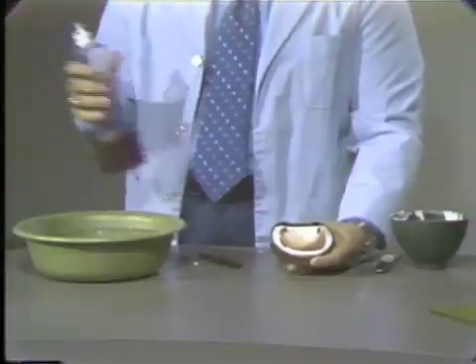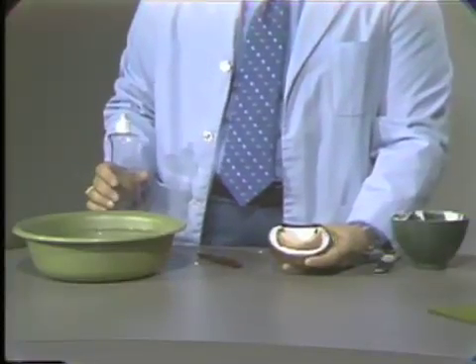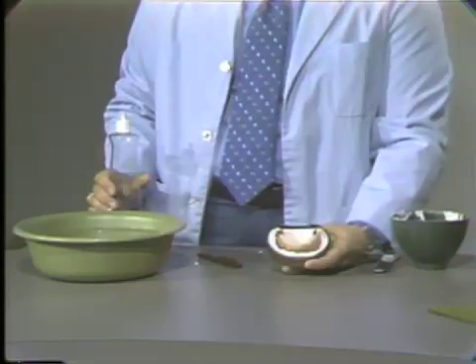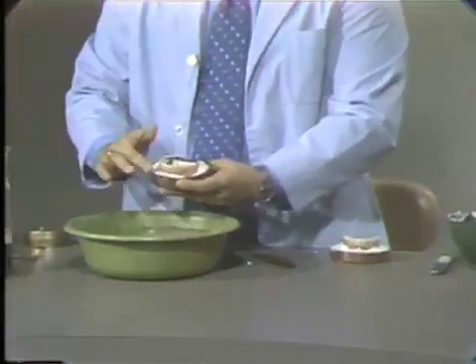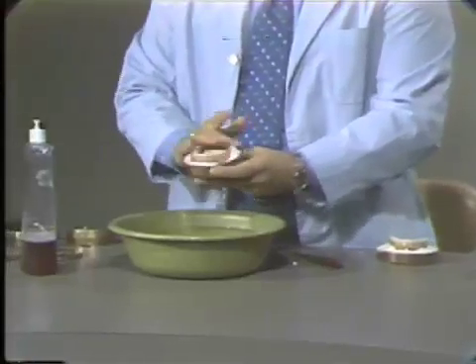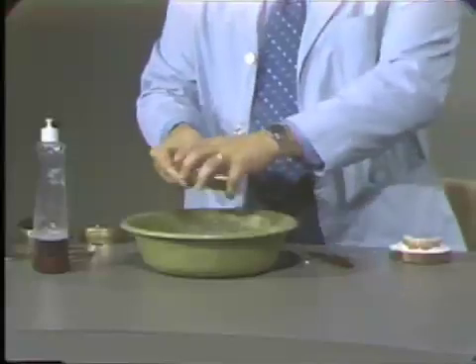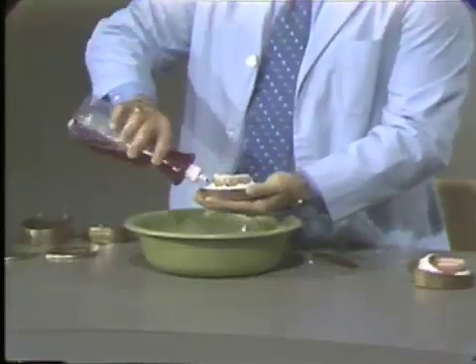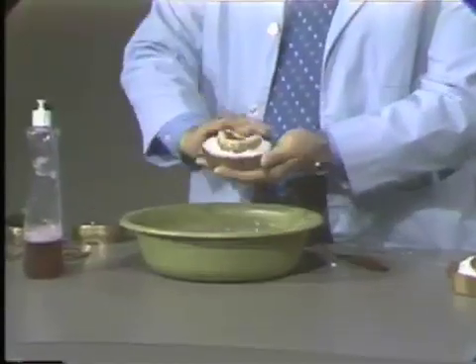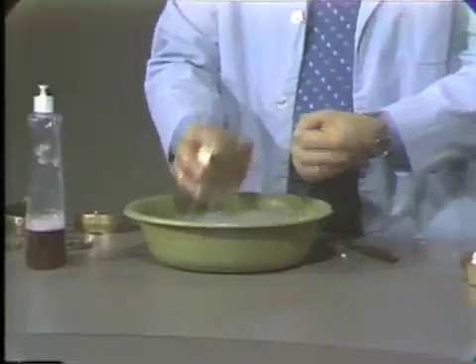Now prior to making our second pour, we will coat both the maxillary and mandibular model with red soap, so that we will have a separating media prior to our second pour. You simply place a little red soap on the flask denture, and then rinse it off quickly. I'll do the same thing with the maxillary denture. This red soap again acts as a separating media between the various pours.